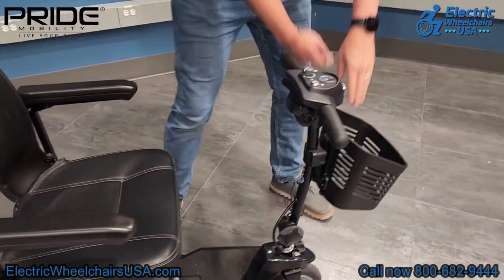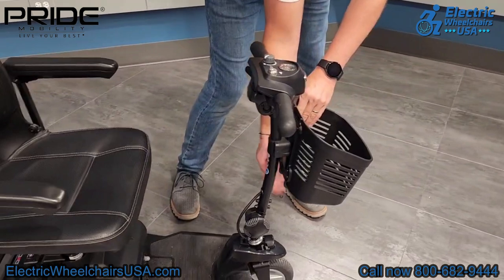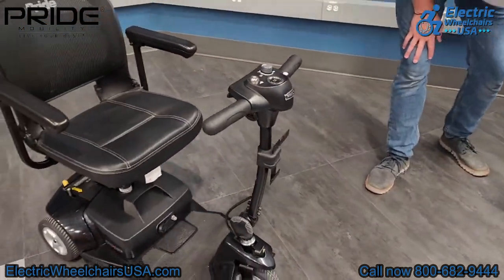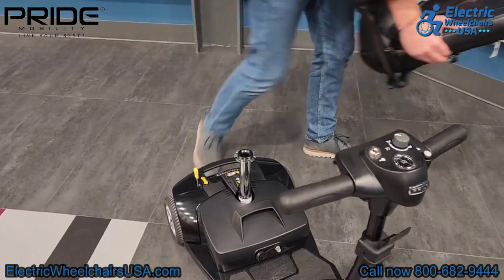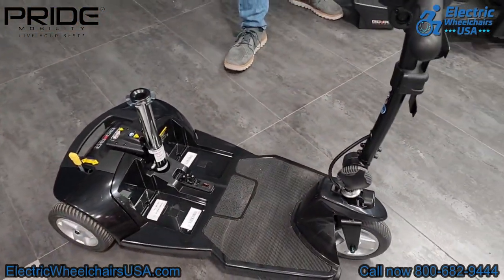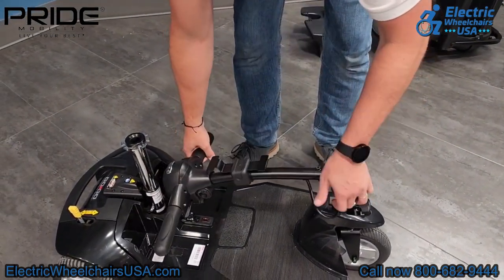To take apart the GoGo Ultra X it's super easy. First, pop off the front basket by tapping it from the bottom and it comes right off. Next, lift the lever used to swivel the seat and pull the seat straight off. After that, pull the battery pack off.